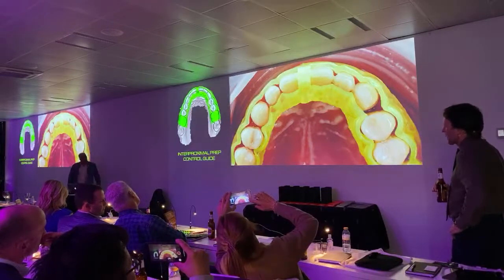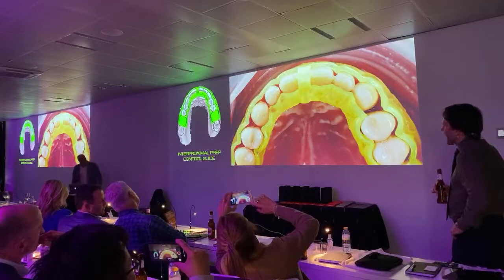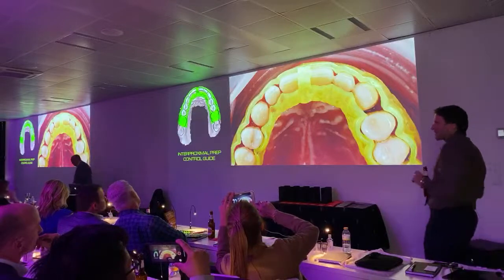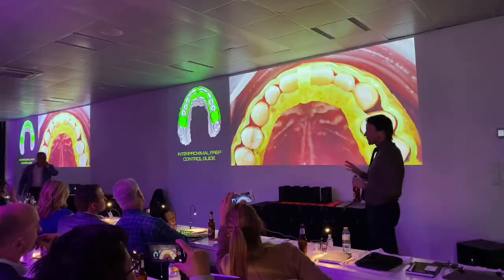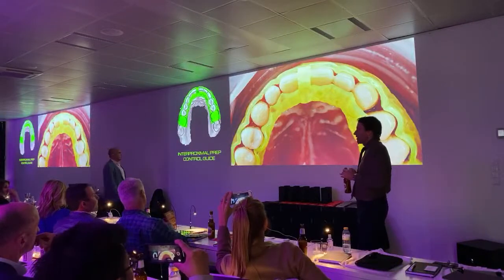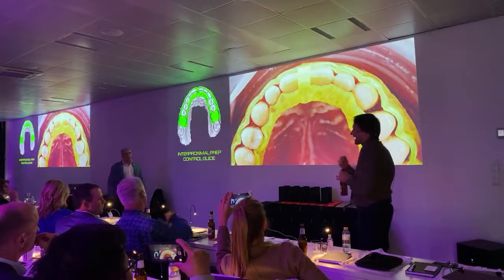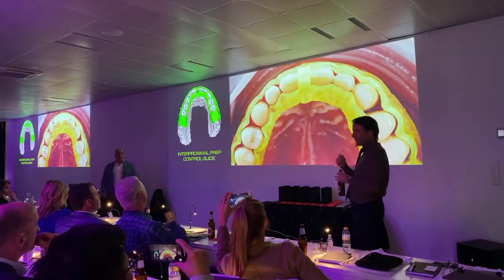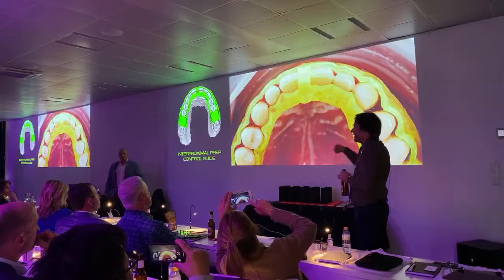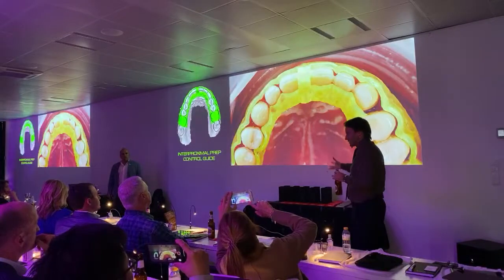Okay? So actually, we have 3 steps into the process of what we call partially guided, because we are leaving the name totally guided to preparation when we have tools that are actually going to mill the teeth inside the mouth, or completely guide the handpiece. That, for example, first fit technology that we are already using is a completely guided tooth prep system.